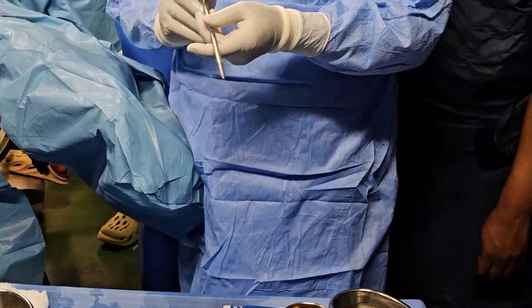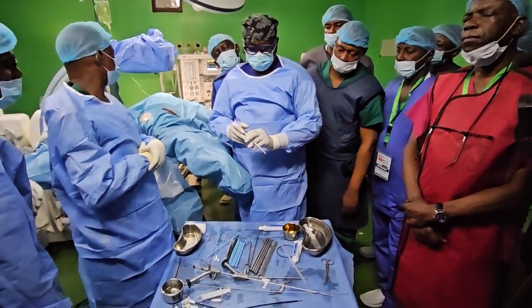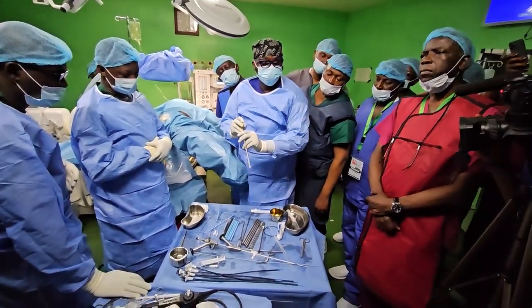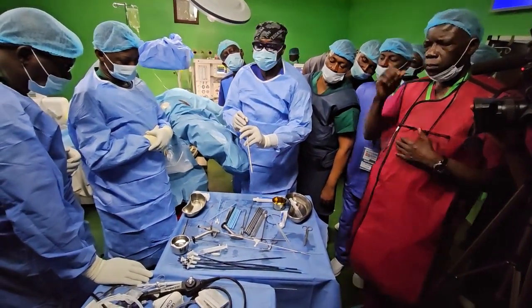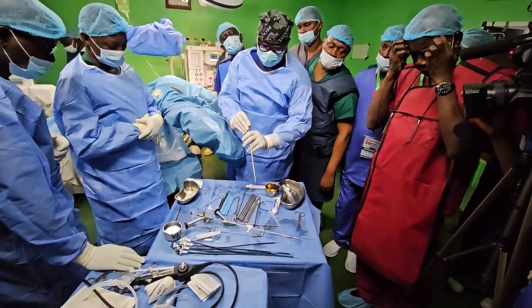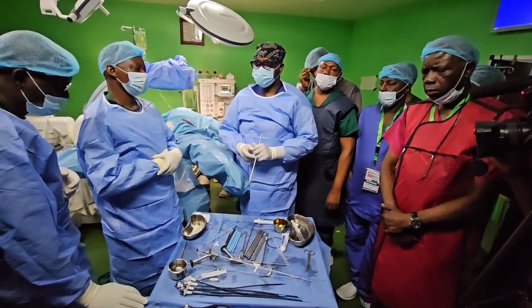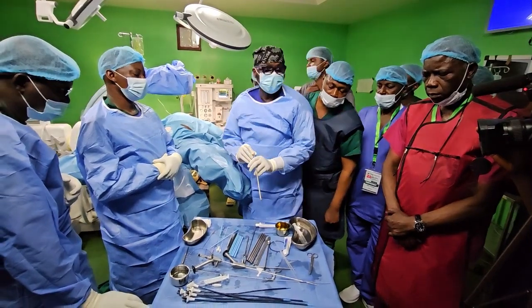And let me say that when you are dilating, to avoid over dilatation, you don't push like this. You don't push. What you do is screw gently, you maintain slight pressure against the tissue, and you are screwing. This way, you don't accidentally push and avulse the infundibulum and damage the kidney. So you do it gently under fluoroscopic guidance, and you get to where you are going.